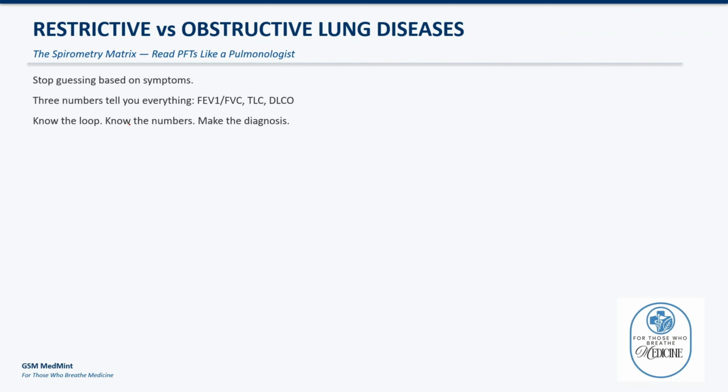Today we are mastering the pulmonary function tests. A patient comes with progressive dyspnea, you order the pulmonary function test. The FEV1 is 65% predicted. Your senior says that FEV1 is low, so start bronchodilators. This is obstructive.